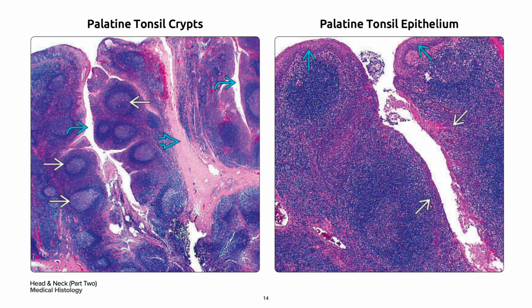On your left are tonsillar crypts, in the curved blue arrow, which represent invaginations of the surface mucosa into the lymphoid stroma. Unlike lymph nodes, the tonsils lack capsules, sinuses, and trabeculae, but do have connective tissue bands that extend to the surface, pointed out in the bold blue arrow. The stroma is mainly composed of lymphoid aggregates, in the single white arrow, and interfollicular small lymphocytes.